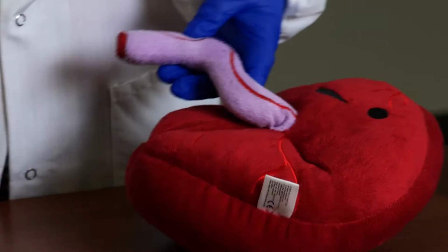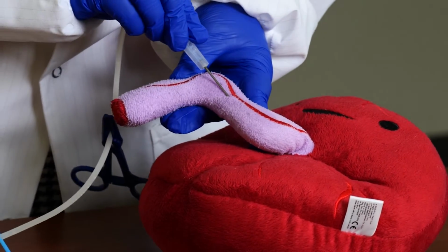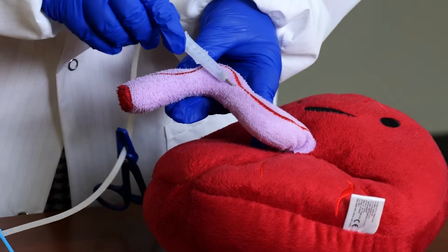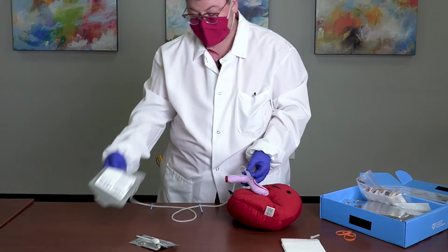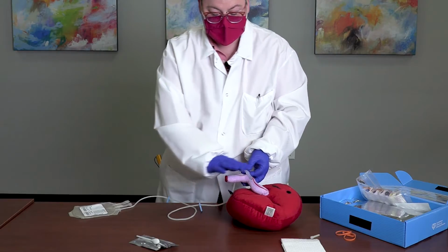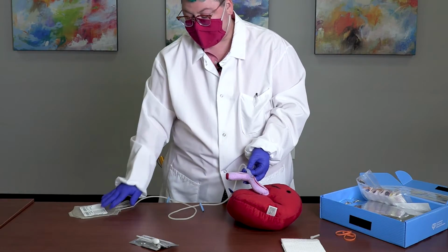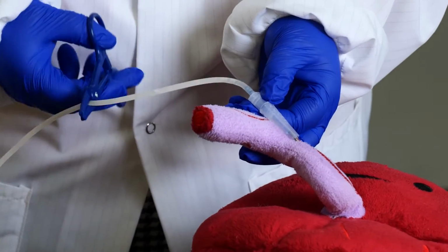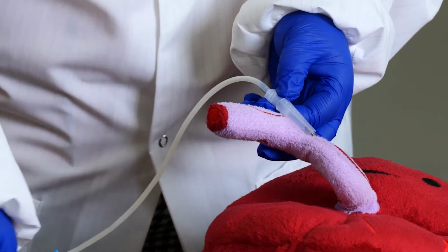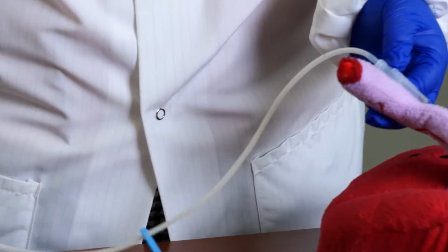For the collection, you'll want to use the needle bevel down, inserted into the cord. It does not matter if it is inserted into a vein or artery. The collection bag should be slightly lower than the umbilical cord to aid in the blood flowing to the bag. Once the hemostat has been released, the blood will flow into the collection bag.